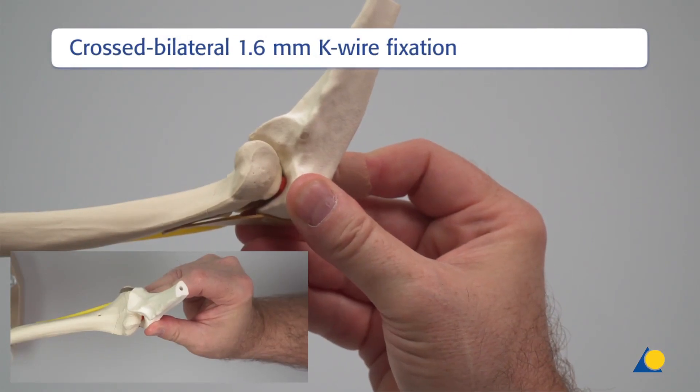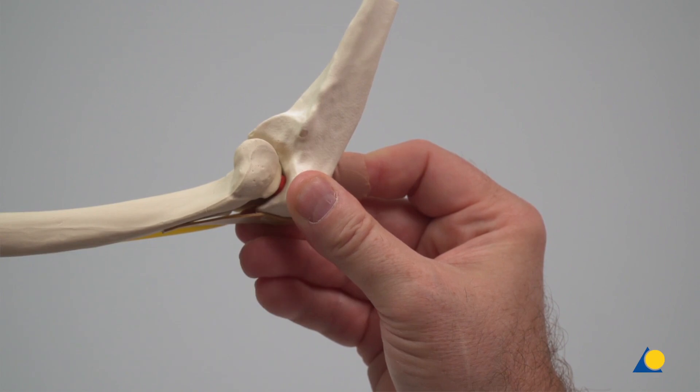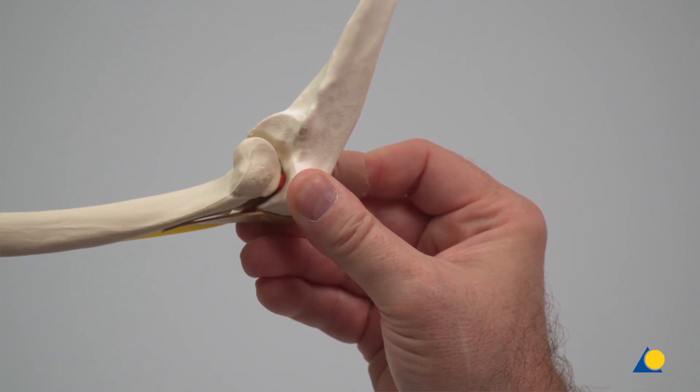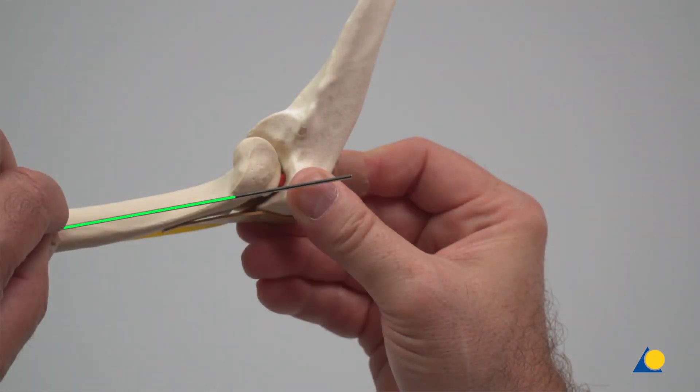The crossed bilateral technique using 1.6 mm K-Wires bilaterally from the radial and ulnar direction will now be demonstrated. In the clinical situation, a small incision or a direct puncture with the K-wire is made over the planned entry points. The first K-wire insertion is planned with a centered alignment to the axis of the humerus shaft in the lateral view. This alignment will result in the K-wire entering the posterior third of the olecranon fossa.